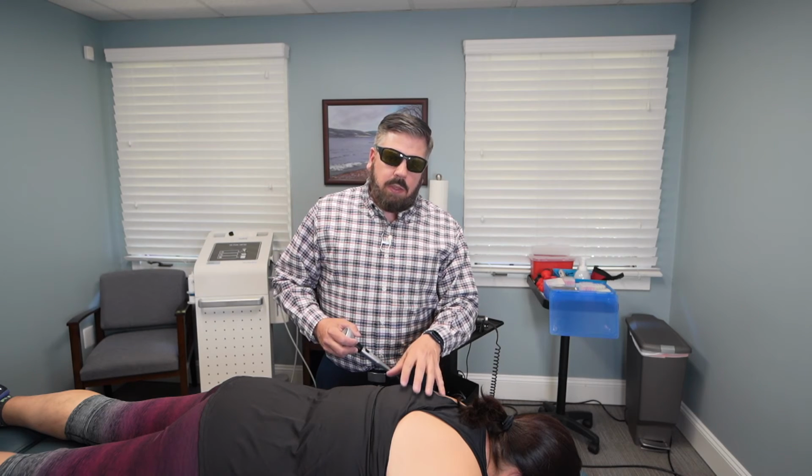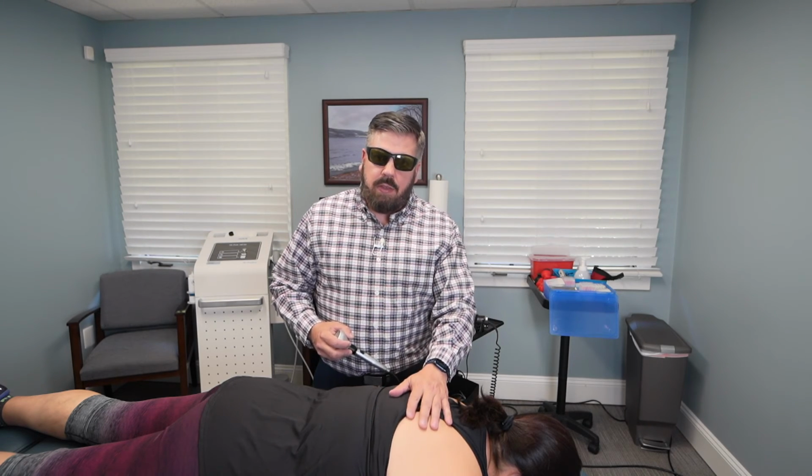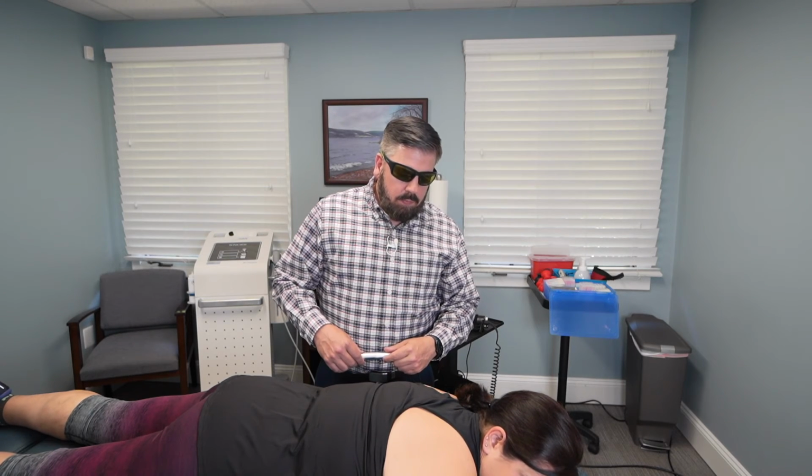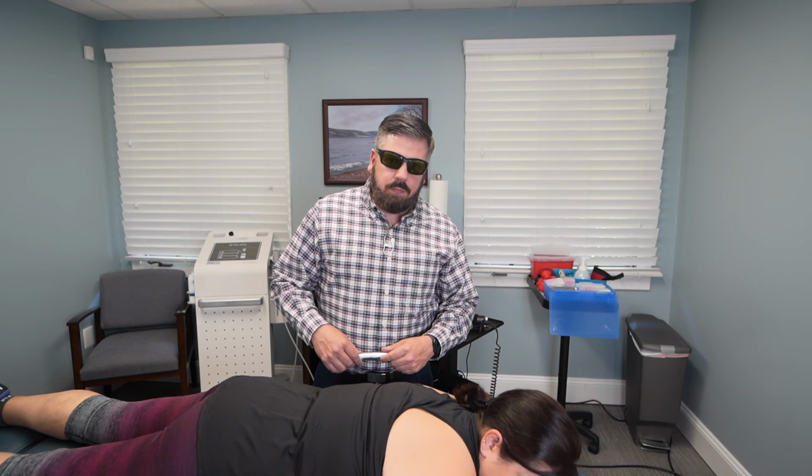So now what I want to do is I want to ask Renee what she felt like while we were doing this area. Obviously, she doesn't have shingles in that. Just describe what the laser therapy feels like. The only thing I can feel from it is a little bit of warmth. It's pretty relaxing and soothing.